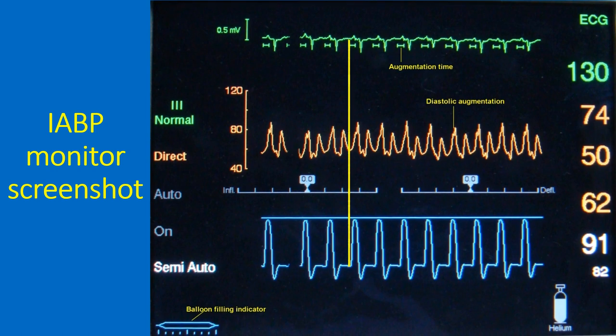Balloon inflation and deflation can be triggered either by the ECG or by the pressure tracing. In auto mode, the choice is made automatically by the circuitry. The augmentation ratio here is 1:1, meaning that all cardiac cycles receive augmentation.